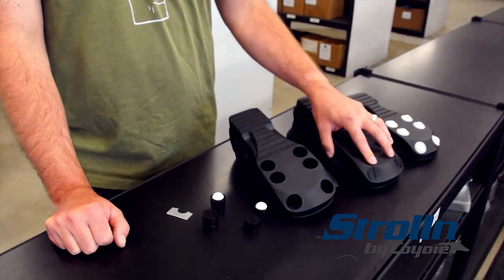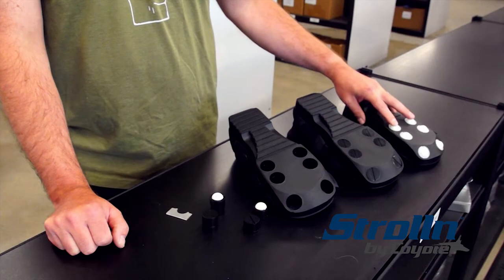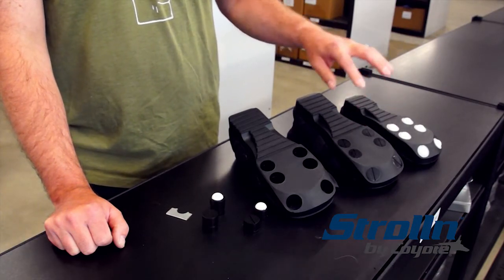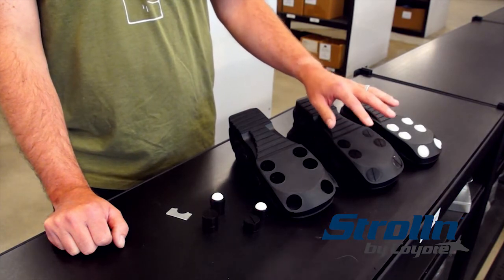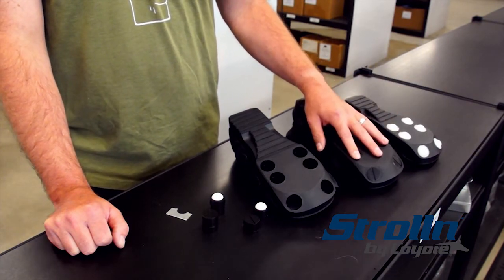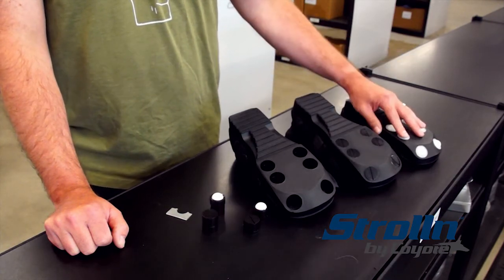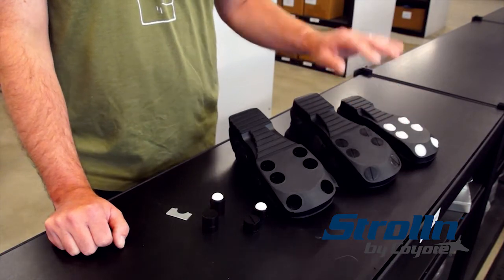Today I'm going to show you guys the Coyote Strolln shoes and how to adjust the Velcro, and also how to replace the retractable bushings with a plug if your patient has maybe no issues with one of their legs and you want retractable balls on just one side of your foot but none on the other.